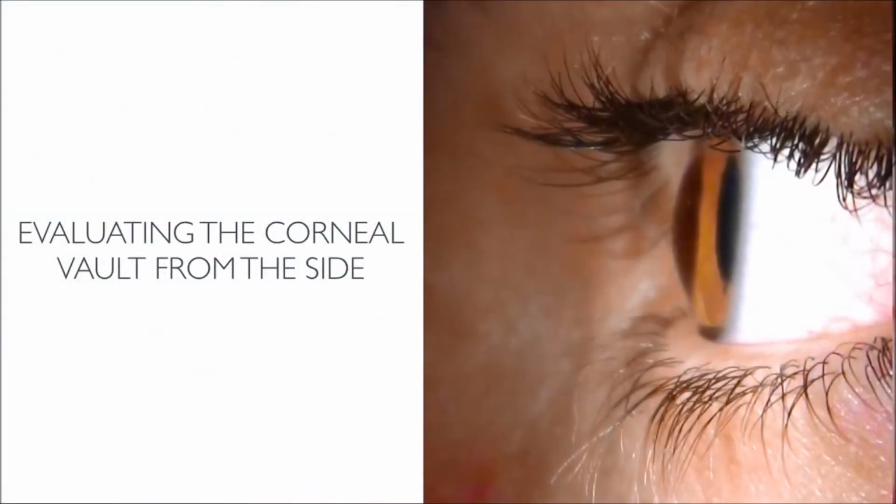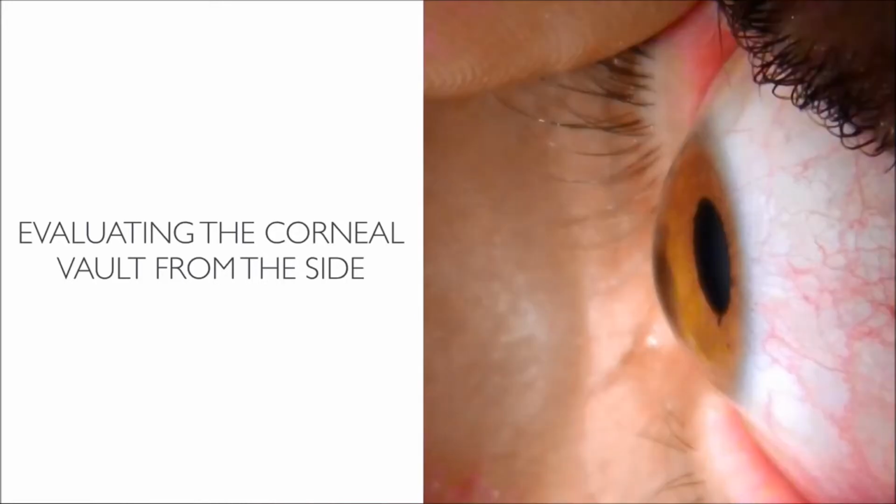So let's evaluate this patient. If we look at that, the cornea is not protruding greatly. I would say that that's a fairly low sag design lens. But I need to see where the lens rests. The lens rests on the sclera, so we have to retract the eyelids, and then we can get a better appreciation of where that lens is going to settle down to.